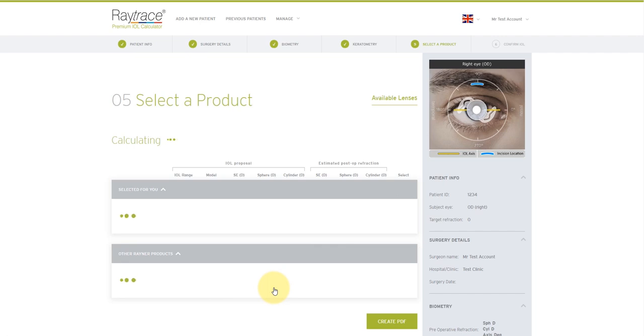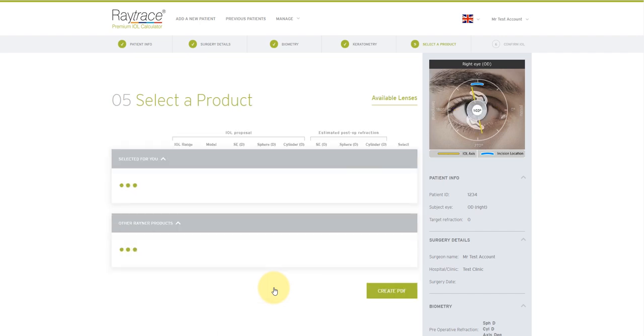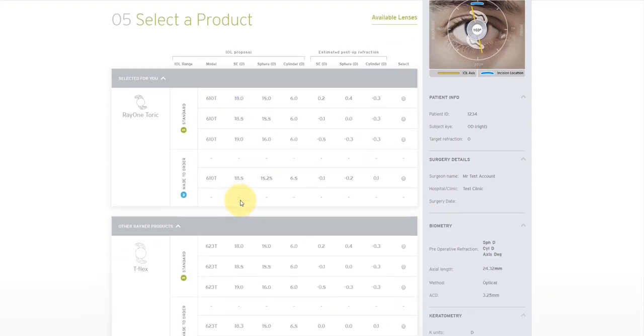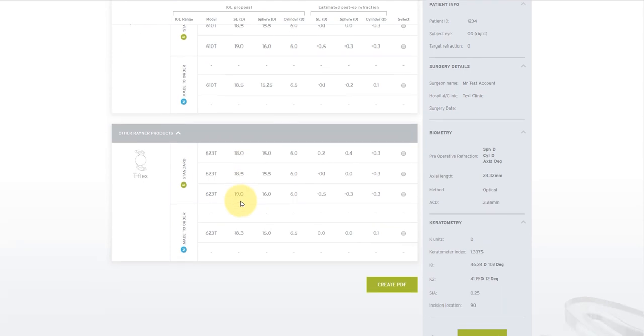Raytrace will now generate a selection of IOL sphere and cylinder combinations that come as close as possible to my target refraction for the patient. The patient's biometric data is displayed here on the right if you need to double check it. Across the top section, you're going to get the preloaded Ray1 options available to you. And then across the bottom section, these will be legacy loadable options available from Rayner.